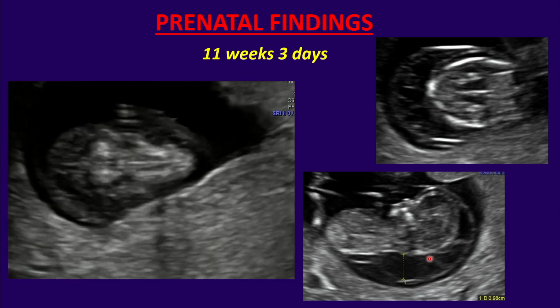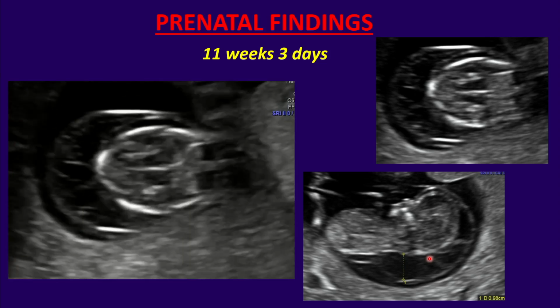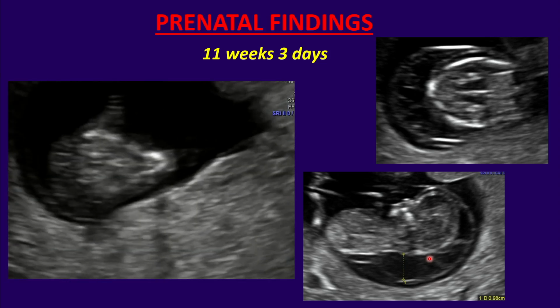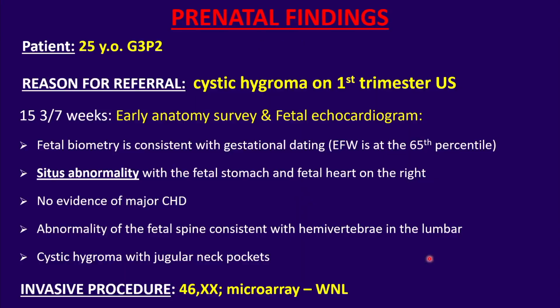So if you work at an MFM practice, what do you do next? Genetic counseling, and you will offer the invasive procedure. It was offered. She underwent CVS, and based on her CVS results, everything came back normal. How surprising, right? So we brought her back for early assessment and an early fetal echocardiogram at 15 weeks gestation, and this is where we start seeing some changes.